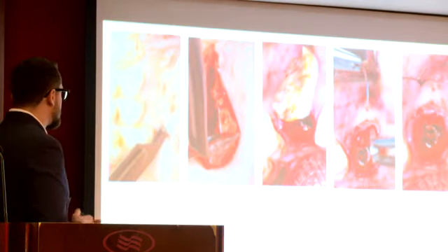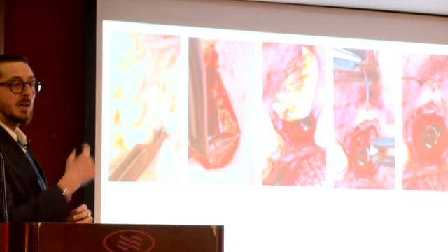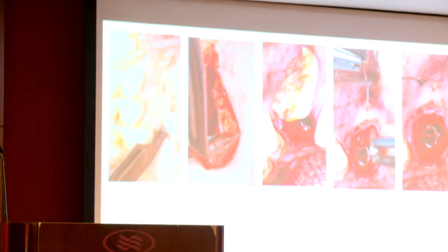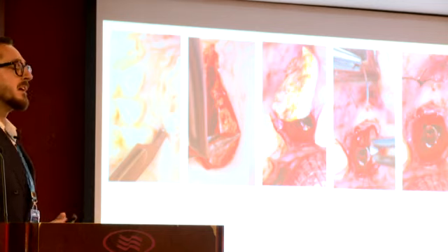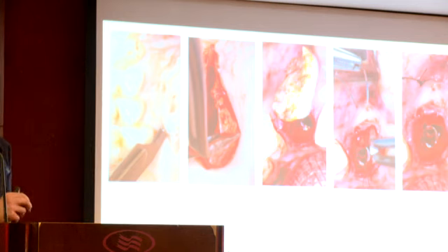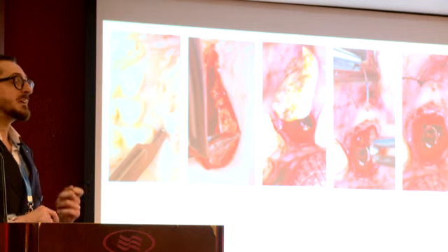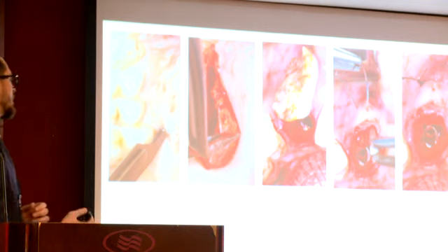So we can see the harvesting and suture technique. First, we have to prepare the buccal flap. I mean, it's not a proper flap. You have to tunnel the flap. You can do it in a split thickness in thick phenotype, and I suggest in thin phenotype to do it in the full thickness in order to avoid any kind of perforation of the soft tissue that will complicate the treatment.